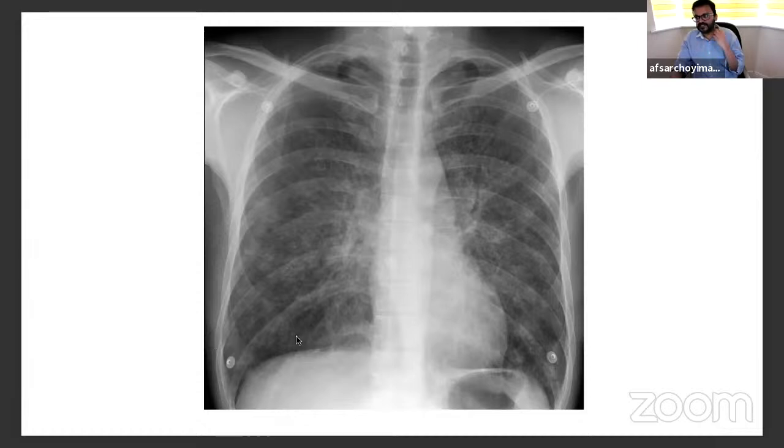So initially I just stare blindly, and most of the time we may get the findings, then go by the indication. That's how I go. Sometimes some people always start with the apex. Some people always look behind the heart, the review areas, because of past experience, missing something or seeing something somewhere. That's the key thing. You have to personalize it, because if someone says make a habit of looking like this, it doesn't happen. It's not easy to change your habits. So create a habit where you pick everything in your own way.